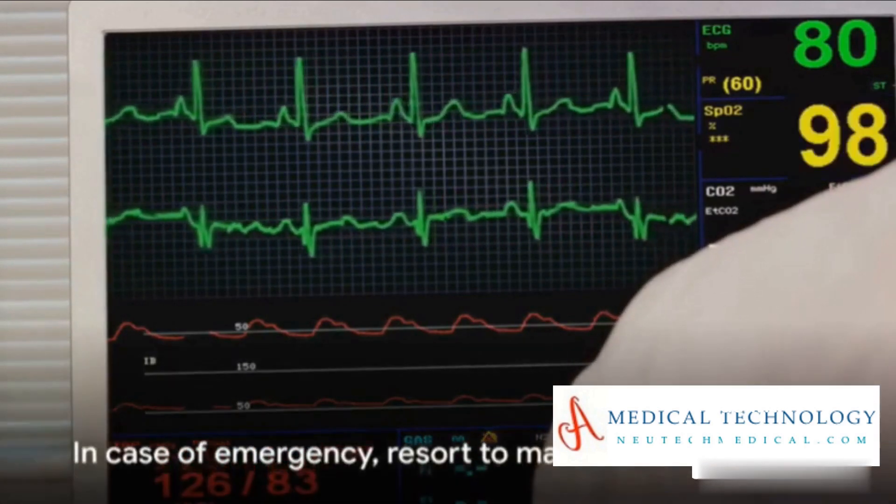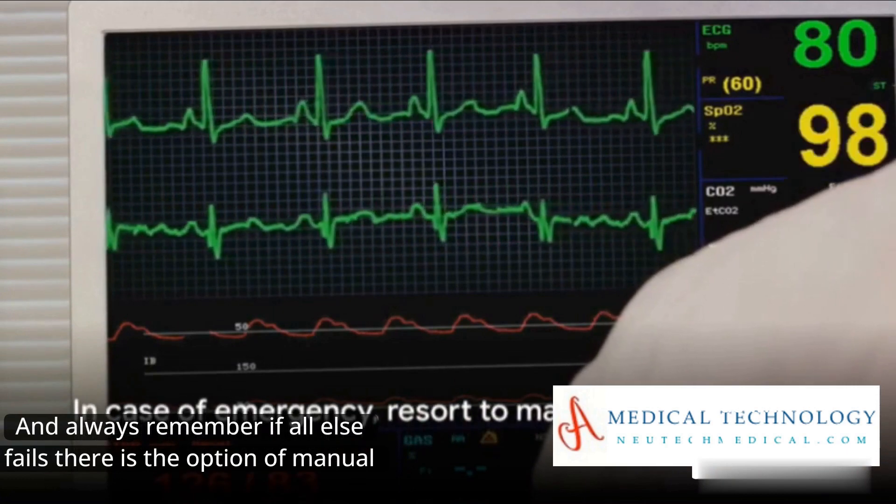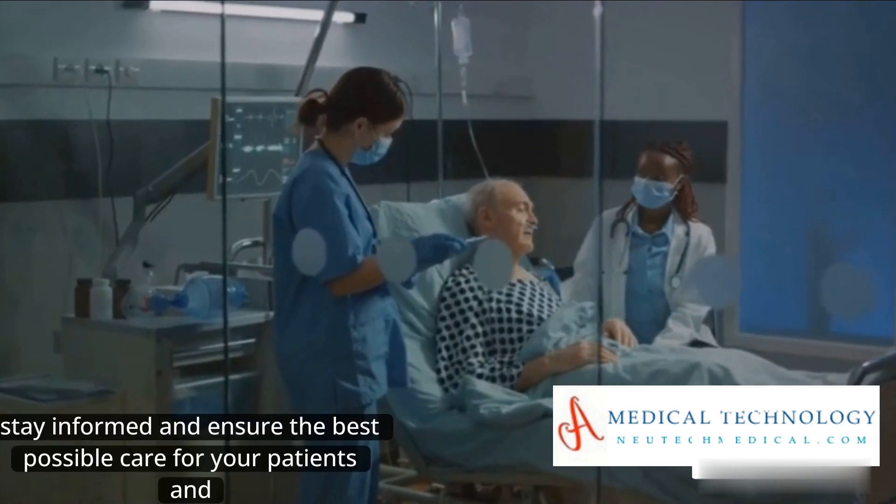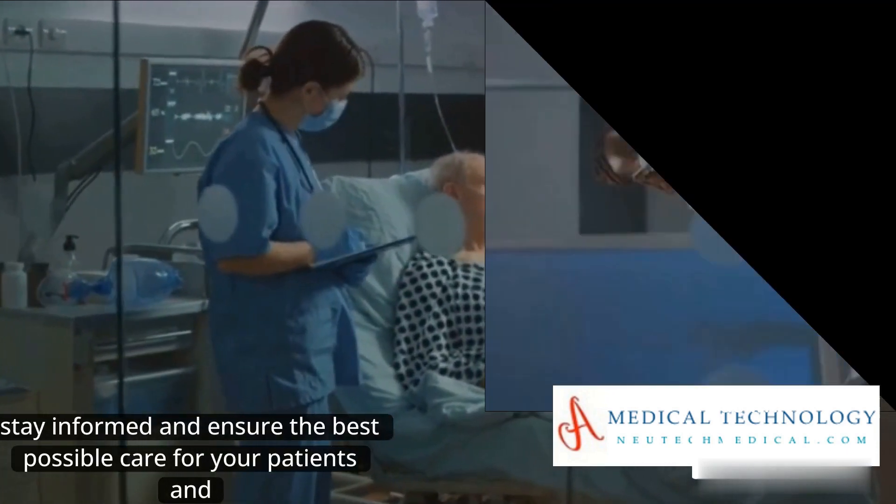And always remember, if all else fails, there's the option of manual resuscitation. Stay vigilant, stay informed, and ensure the best possible care for your patients.